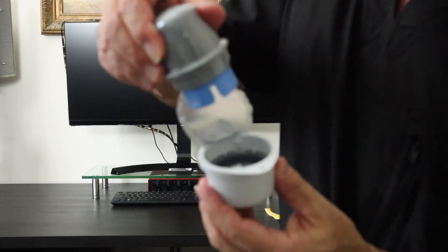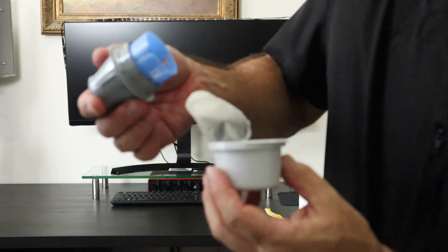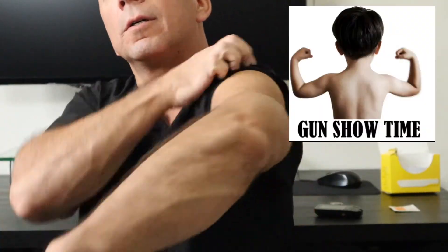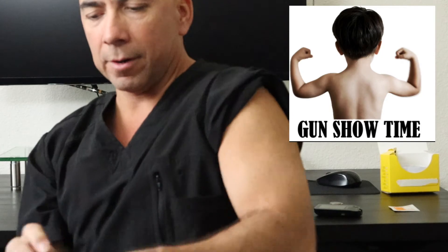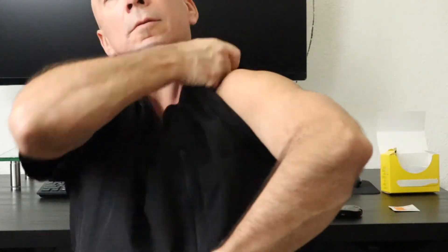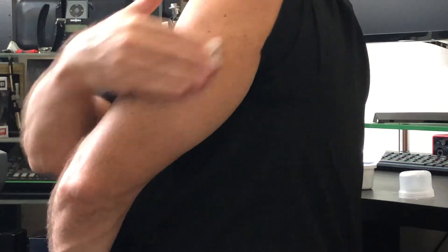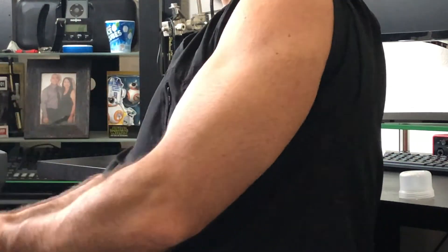So we're going to take this out — now it's already there. First thing, we're going to prep the arm and clean it with a little bit of alcohol. I want it to go not in the muscle — let that dry.